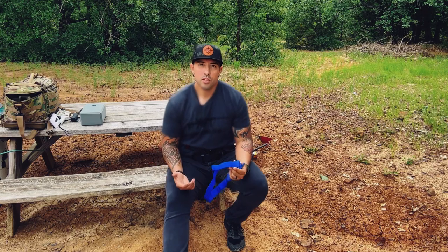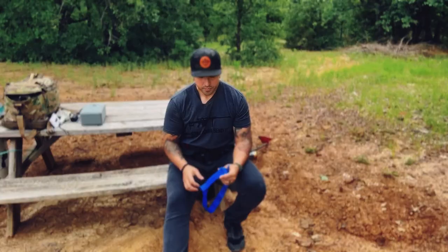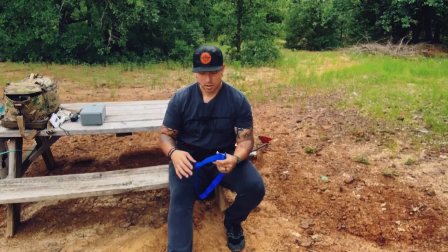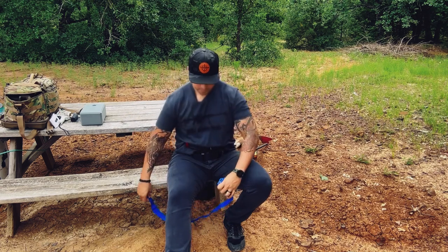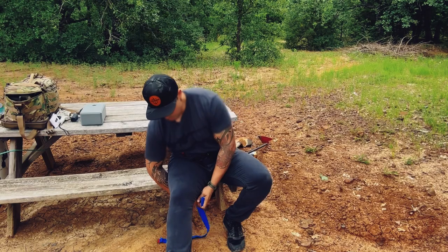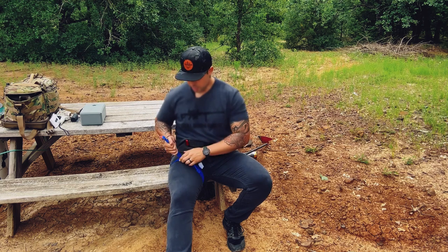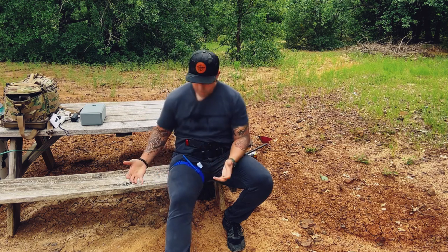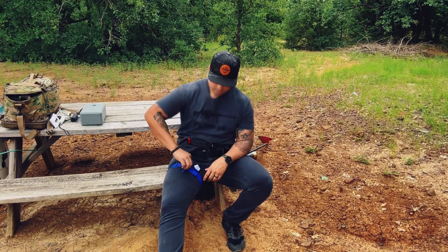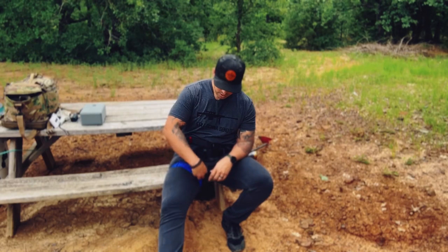Remember what time you put it on — write it down if you're able, or have a bystander relay it to 911. If you're shot in the leg or severed your femoral artery and can't reach easily, the same concept applies as putting it on someone else: take it apart, slide it under your leg wherever you need it — nice high and tight. Fine motor skills and critical thinking go down, so don't overthink placement. Get it nice and tight, attach the velcro, tighten the windlass down, put it in the trap, and close it off.